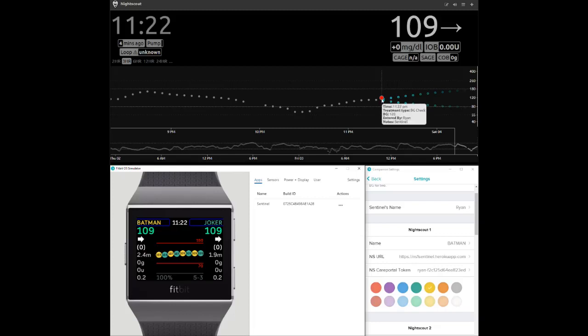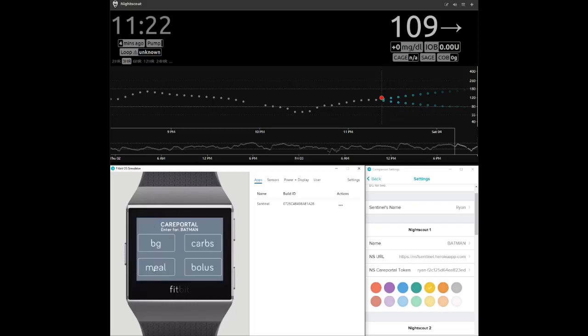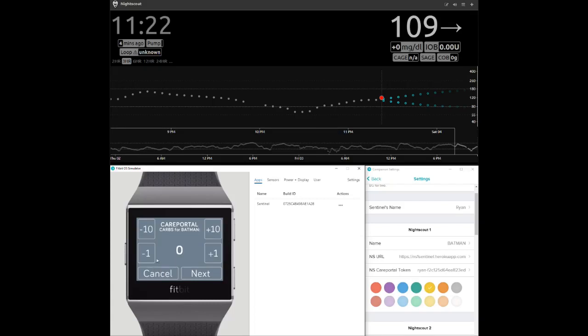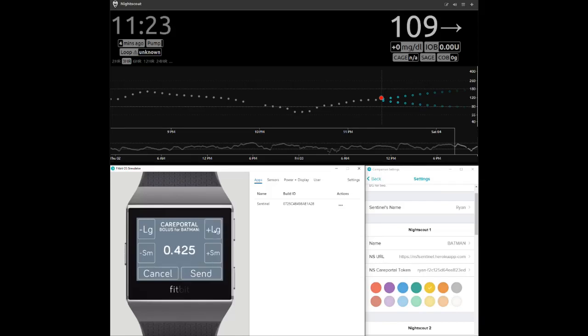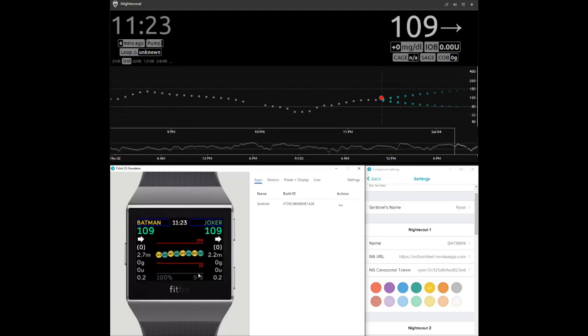Next, here is a care portal demonstration for entering a value for a meal. Touch a name on the screen to open the care portal options window. Select meal, change the carb count value, and press next. Change the bolus value, and press send when ready. Looking at the NightScout website above, note the arrival of a meal icon on the graph with the associated information.